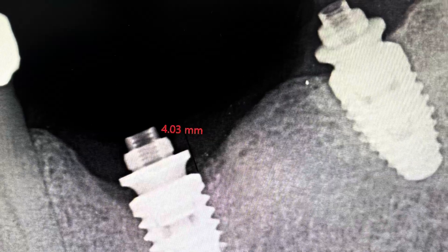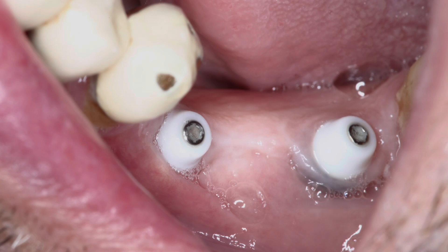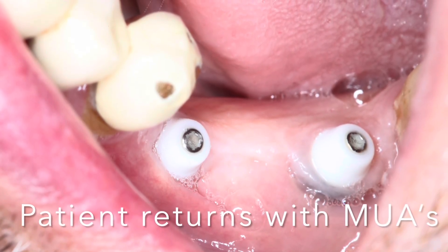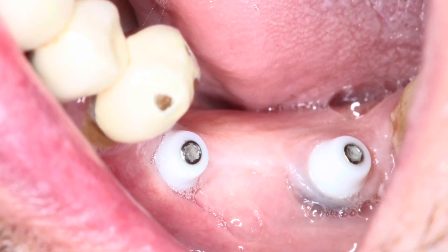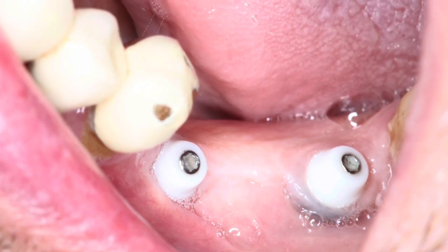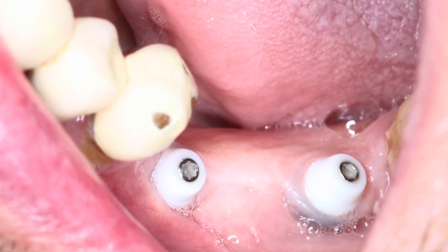The digital goal is to have a digital workflow for bridges on the multi-units and to achieve a full arch scan. I'm going to demonstrate a three-tooth bridge and show some of the techniques we're using. I'm in the middle of testing and verifying full arch scans, going back and forth between analog and digital. Let's have a look at the scans required to do this three-unit bridge.